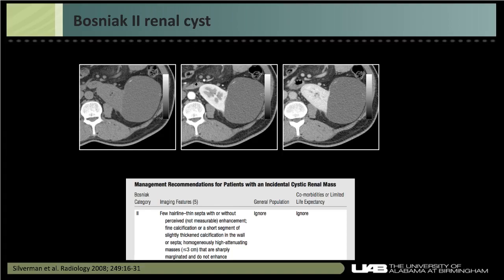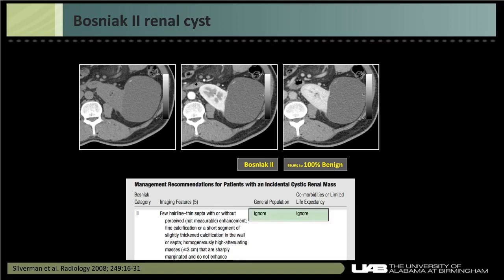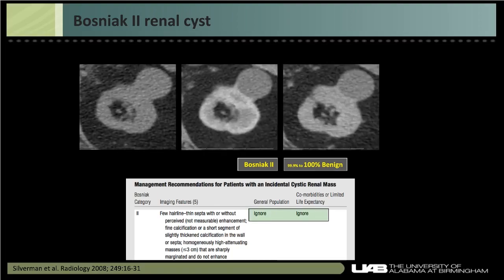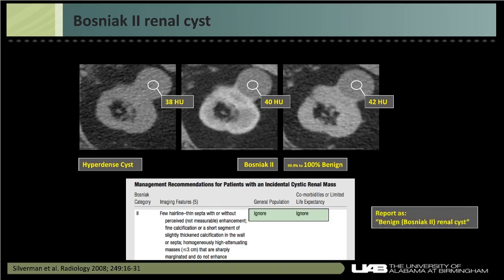Bosniak 2 renal cysts measure fluid attenuation with a few thin septations and fine calcification. Almost all are benign, and we can ignore them. A hyperdense cyst that does not enhance and is homogeneous with no measurable enhancement is also a Bosniak 2. I like to report these as 'benign (Bosniak 2 renal cyst)' — the word 'benign' communicates to everyone what's intended, while the Bosniak classification is preserved for urologists or future follow-up imaging.